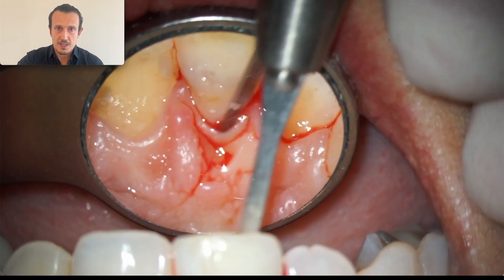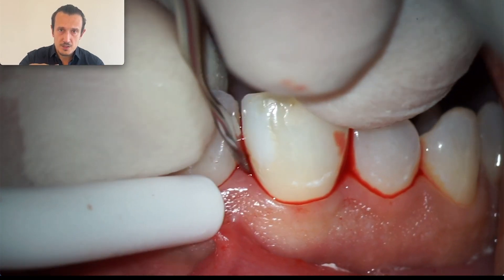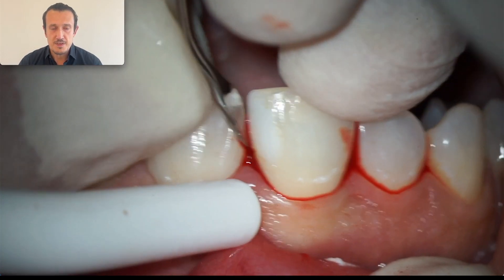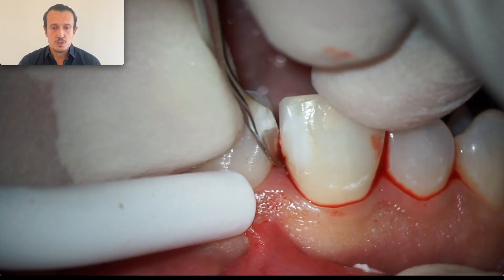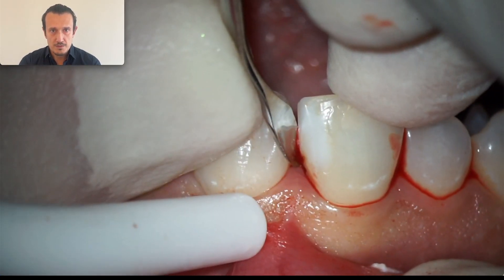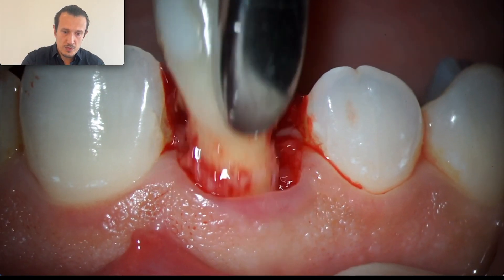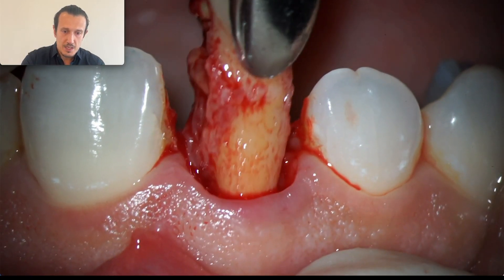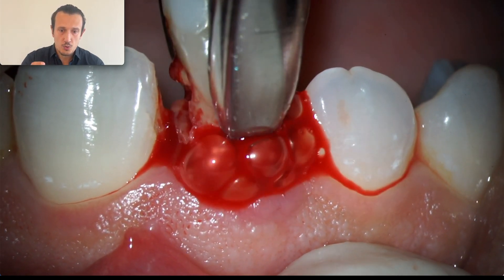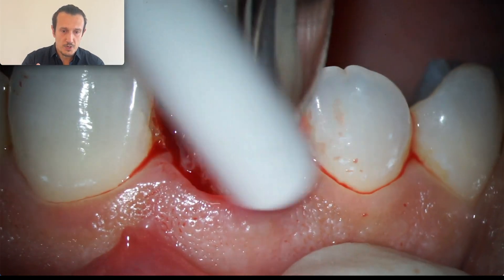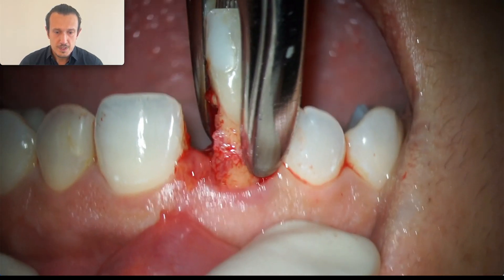Here, because of the resorption, in some places I need to go deeper. This is a VT1 instrument from Deppeler — I'm using this to make a small box section of the teeth, and then I will very gently grab the crown with the forceps. I was lucky in this case because the tooth comes out as a whole — it doesn't break.